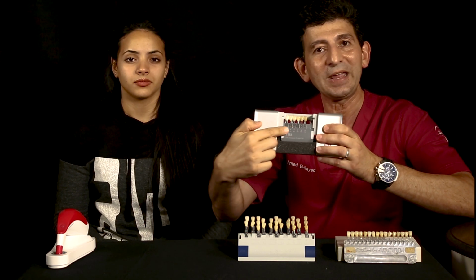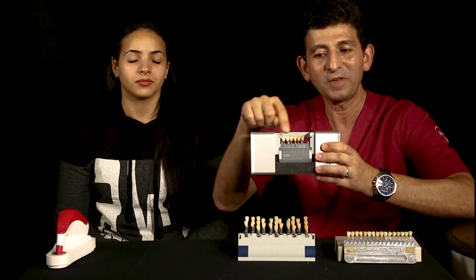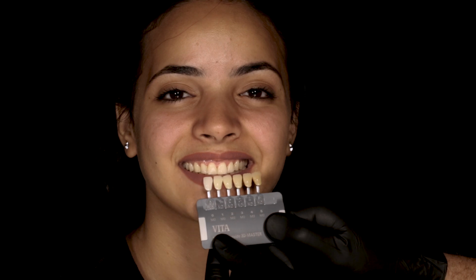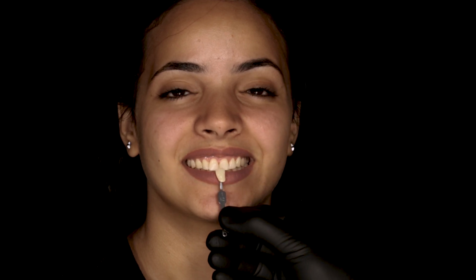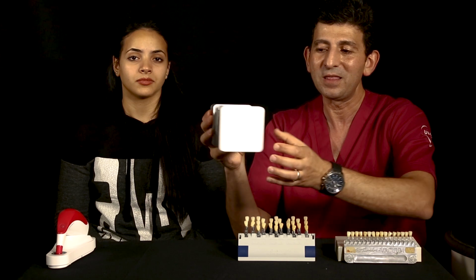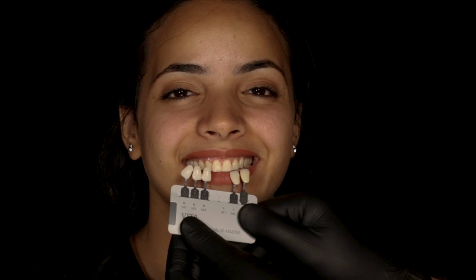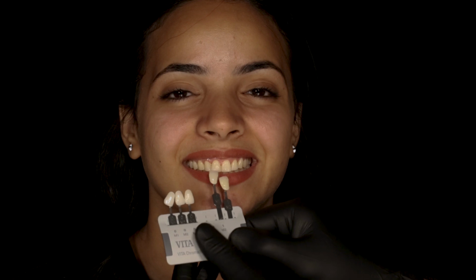So you start with a tray that has only 6 buttons for value selection, and you select a number. Say number 1 is very close to the tooth value-wise, in degree of lightness and darkness. After you select the number, you then pick the chroma trays from the back and pick tray number 1. Then you put it next to the teeth to check the chroma. So you start with value first, and after that you check the chroma. It's linear, easy, fast and predictable.